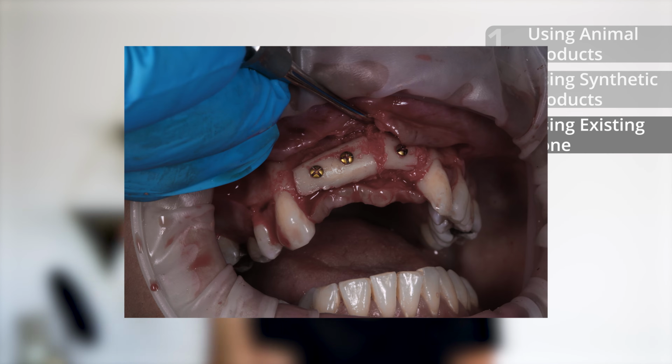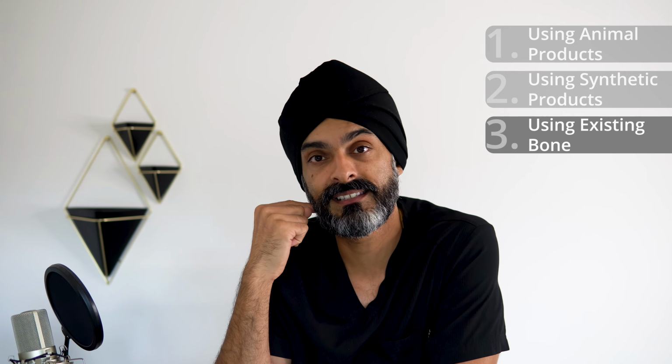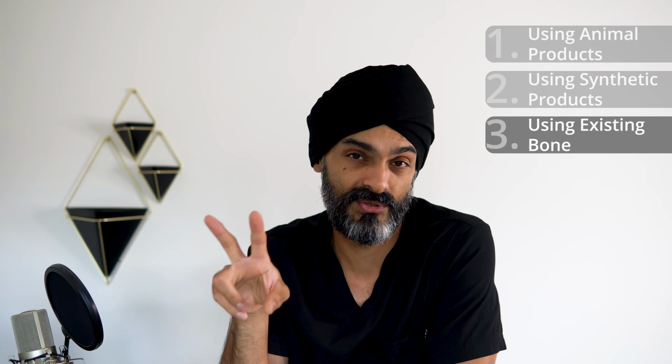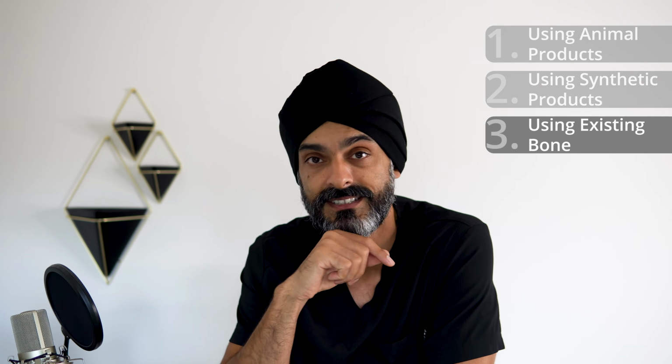Okay, so expect a week of downtime with this kind of bone graft, but the results are really good. Also, because we've got 2 sites, it's almost twice the amount of surgical time. So this is probably the most expensive of all the types of bone grafts that we do.